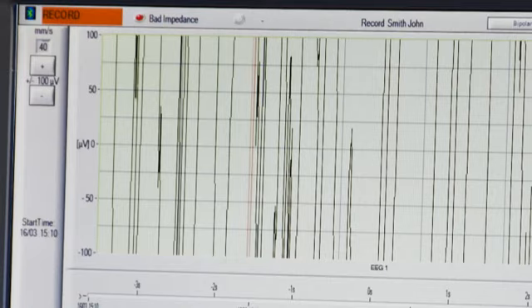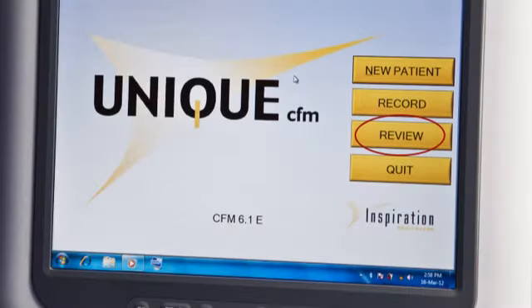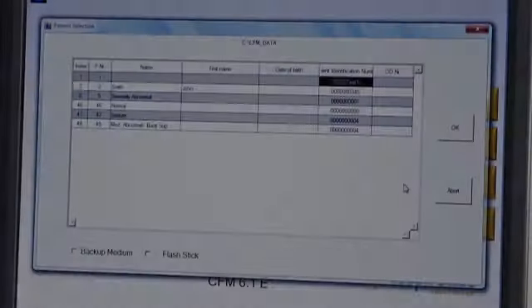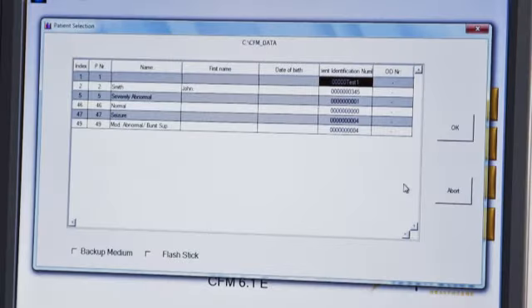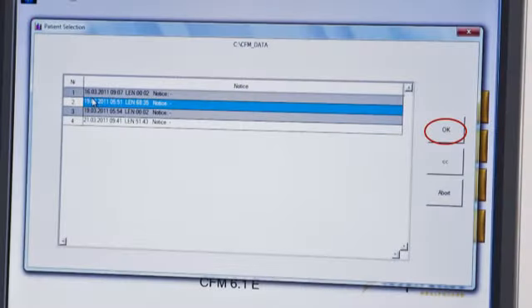The user can review a trace through the master screen. Click on the review button. Select the patient data you wish to view and click OK to be taken into the recording.